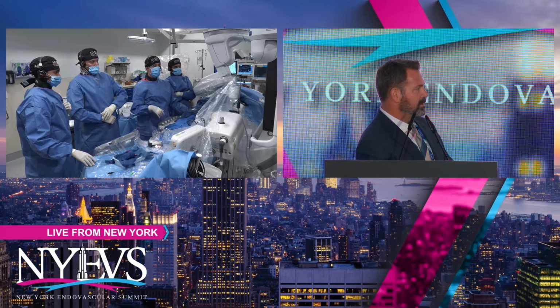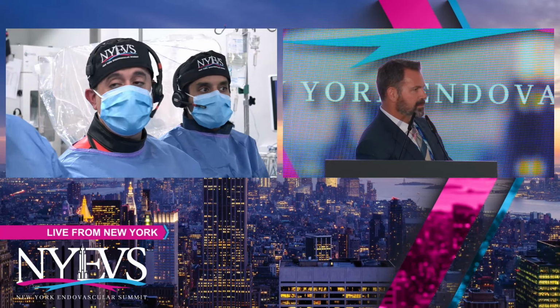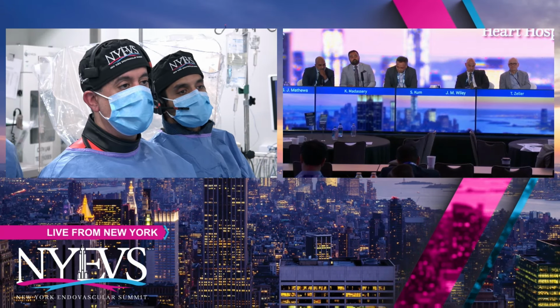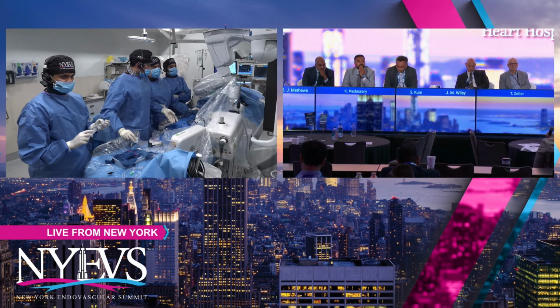DES there, at the ostium? Yeah, that ostium one, definitely probably more straightforward. DES, not a Supera, unless you're coming from the other direction. Yeah, that's 6 by 40. 6 by 60 first. Which one? Middle first.